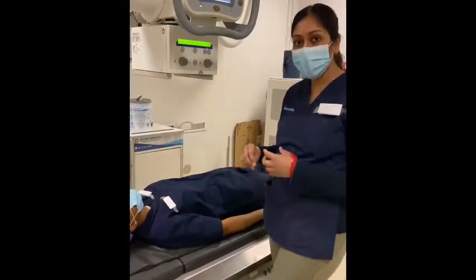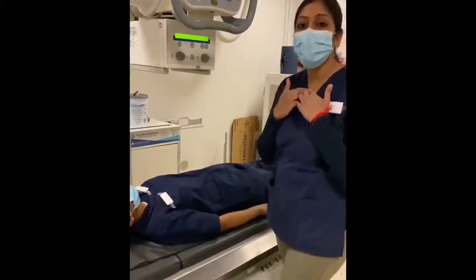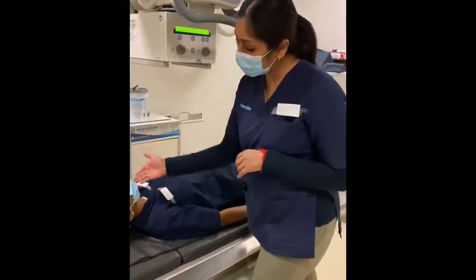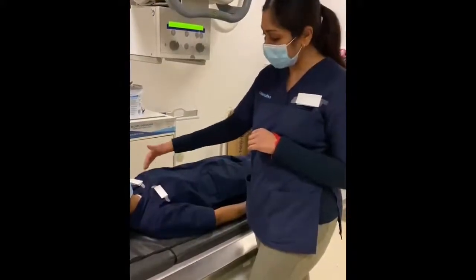You can use a thin pillow, but try not to use a thick pillow because you don't want the chin to be lower down and superimposing on the upper portion of the T-spine. When your patient is lying down, make sure that the chin is elevated sufficiently so there's no superimposition on the upper portion of the T-spine.